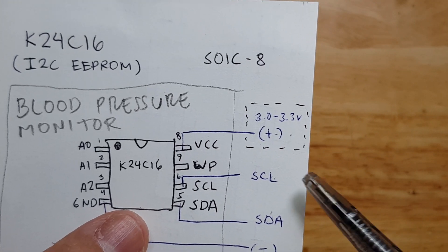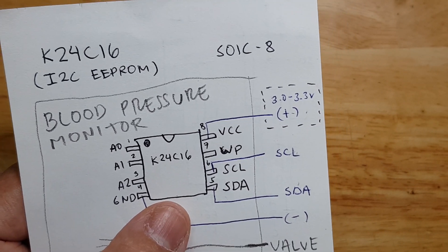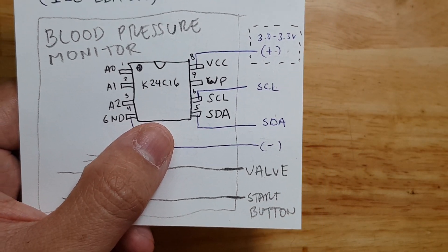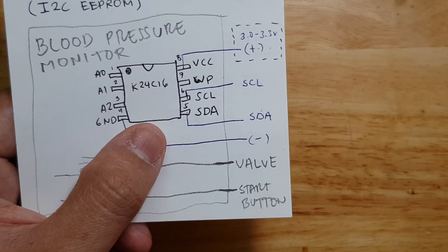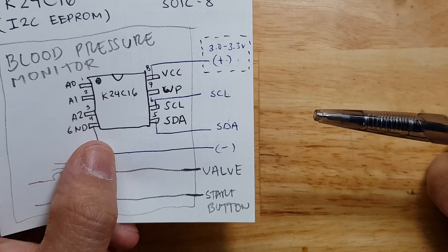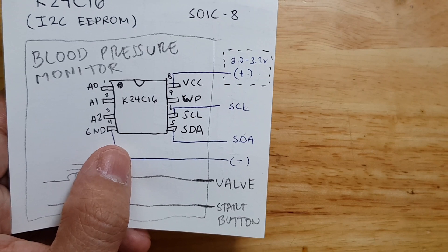A quick side note: the voltage running on our blood pressure monitor is 3 to 3.3 volts because it is powered by two AAA non-rechargeable batteries. Arduinos are not at this voltage level, so it's good to use a device that's already 3.3 volts. You can use a logic level shifter, but I had some issues with that. So what I did is convert an Arduino from 5V operation to 3.3V operation. I will link a video on how to do that.